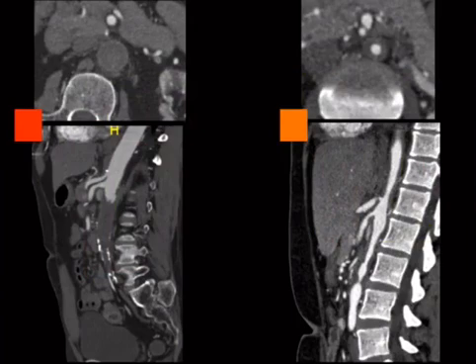So here are two different pathologies involving iliac occlusion or near occlusion. The one in red is totally out, and the one in orange is nearly out in places. But this same pathology could actually cause full-on occlusion. Now, you would say, how do I tell these apart? If you're asked to tell them apart, or you're shown this case and both of the main options are on the differential, this is the strategy that I would use.